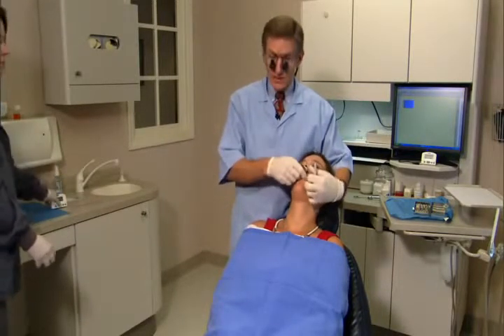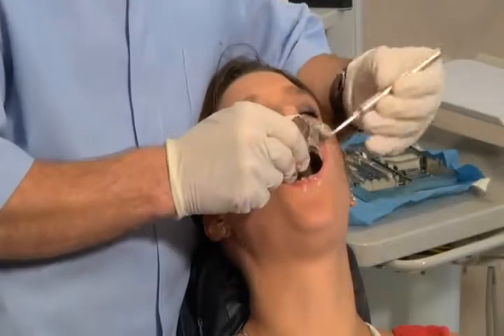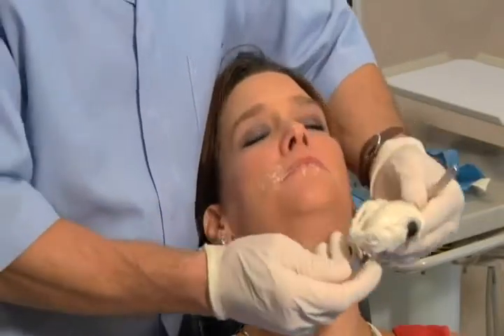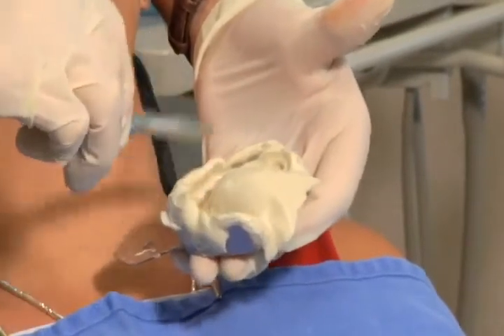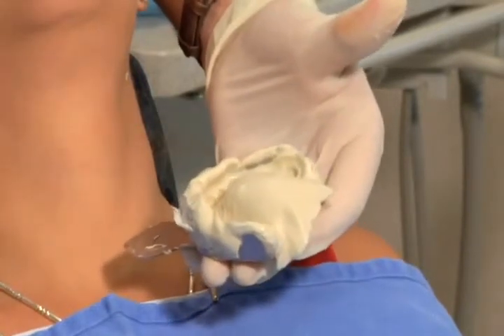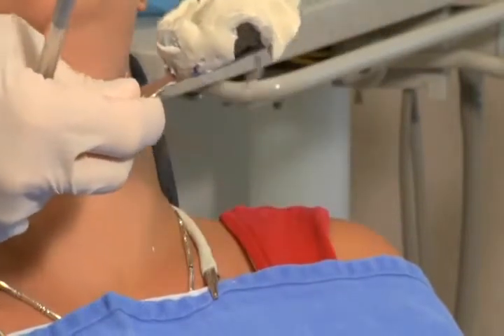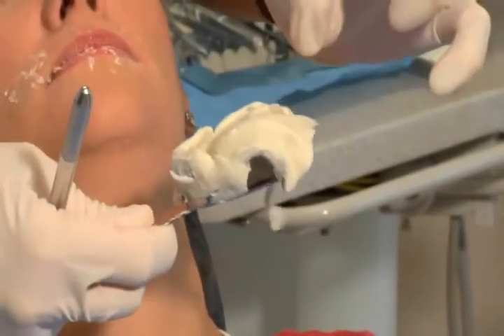When the beep goes off, we'll remove the tray — pop down in the back and remove it with the mirror. Step seven is to thoroughly evaluate the impression. We've got a nice roll all around, picked up all hard and soft structures, not a lot of bubbles. This is a beautiful impression. If you do have a big void or bubbles somewhere, just take another impression — it's not worth trying to work around it.